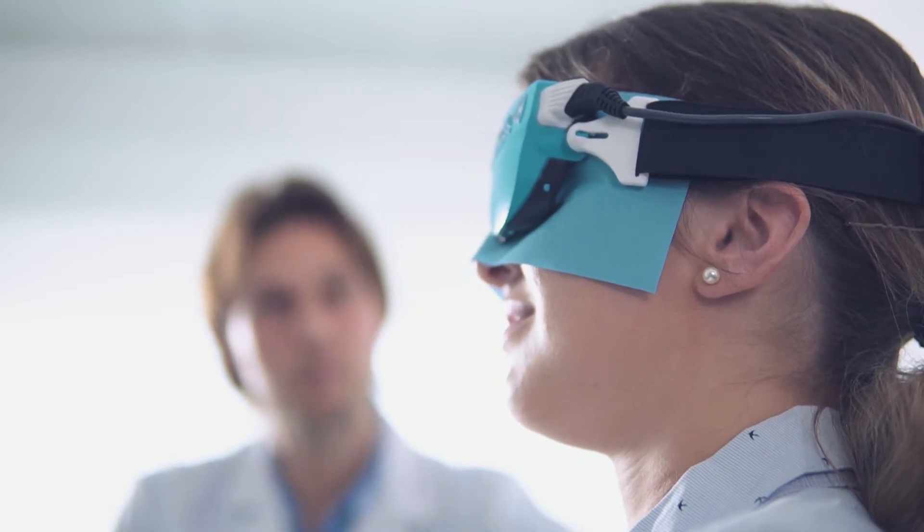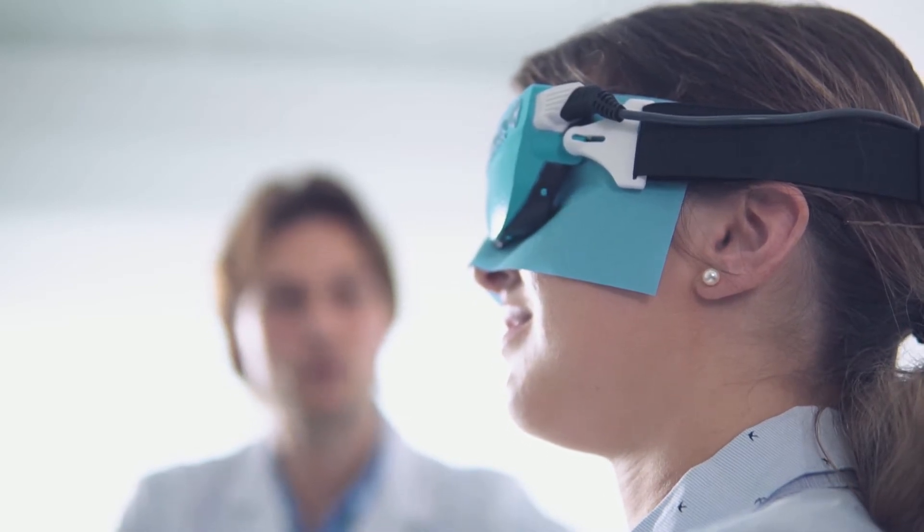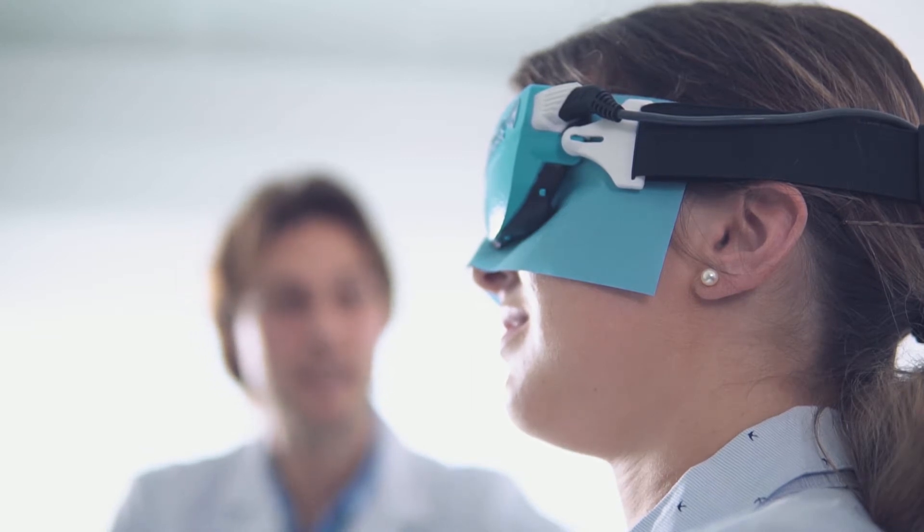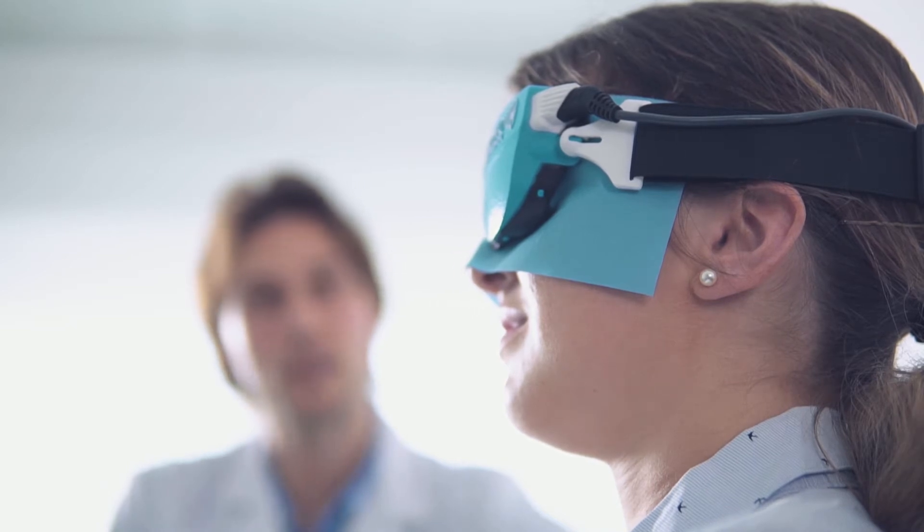At the end of the therapy, please remain seated for a few minutes, still with closed eyes, as you may experience a slight blurred vision. This is due just to the mask pressure on the eyelid.